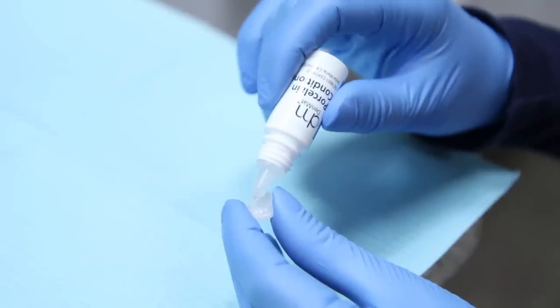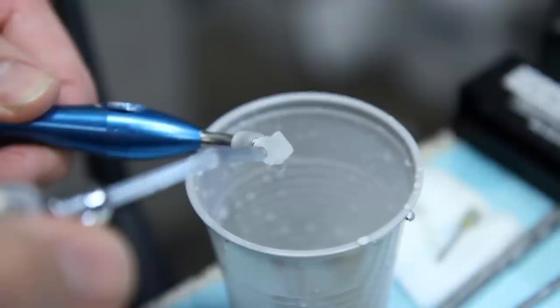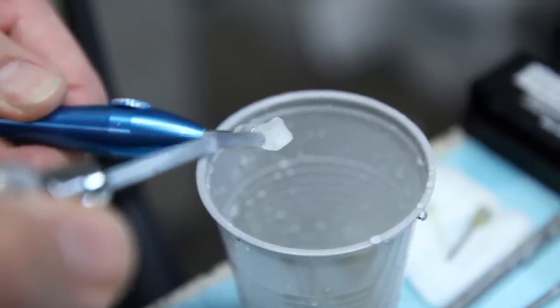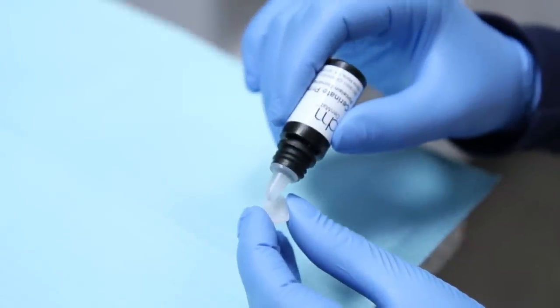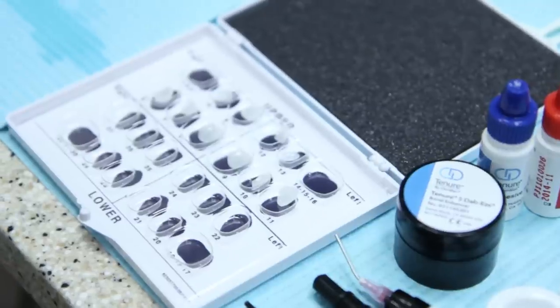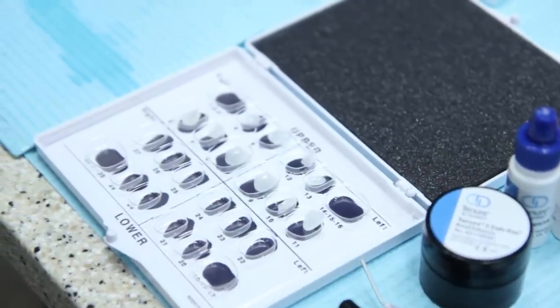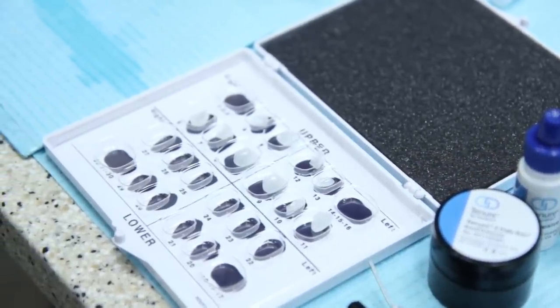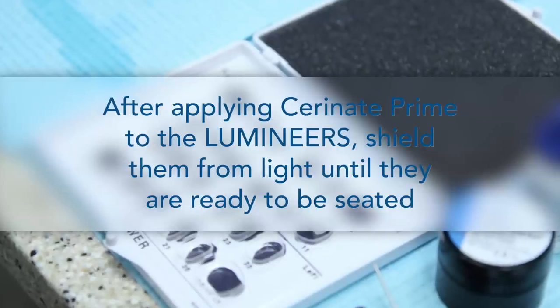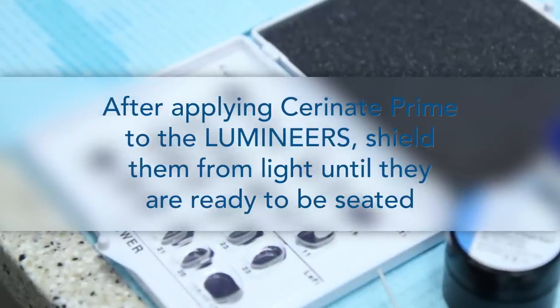After the patient is seated, treat the lumineers with porcelain conditioner for 30 seconds. Rinse and dry well. Apply Cerinate Prime to the lumineers for 30 seconds and blow thin. Place the lumineers back in the case box in their proper slots and close the lid or cover from light. Once Cerinate Prime is applied to the lumineers, they need to be shielded from the light until the lumineers are seated.